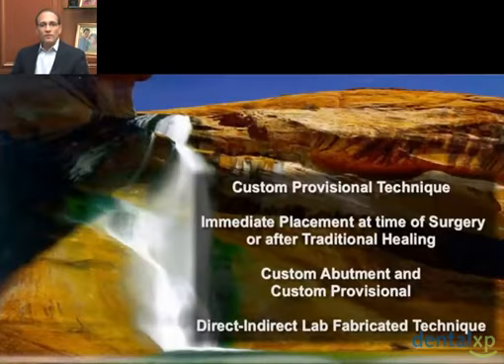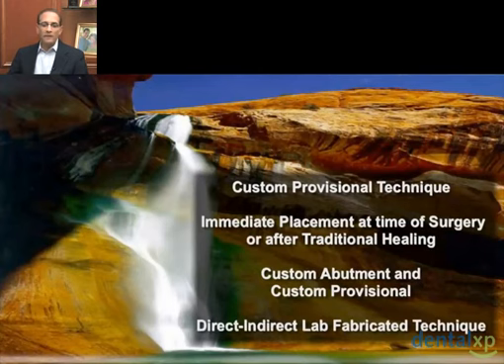Okay, so we've completed our illustration of the direct techniques, both with traditional healing time and with immediate placement. We're now going to switch gears and talk about what I call the direct-indirect laboratory fabricated technique, where we can do a little chairside and laboratory components at the same time. Now the beauty of the direct-indirect is that it can be used at any time you deem necessary. It can be done at the immediate placement time of surgery, or it can be done after traditional healing.